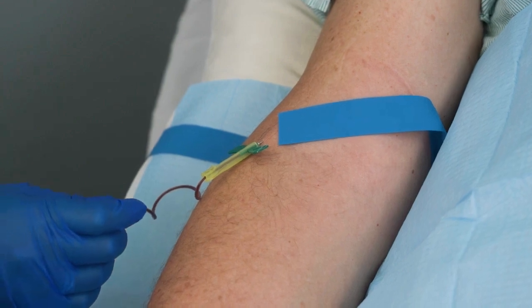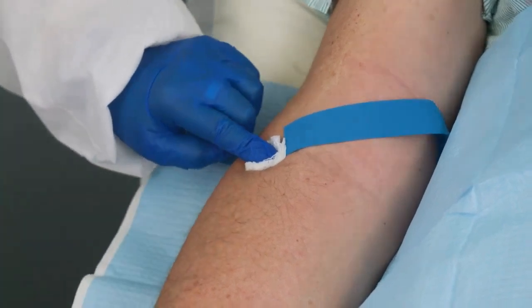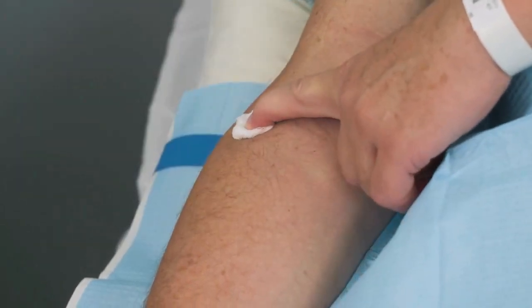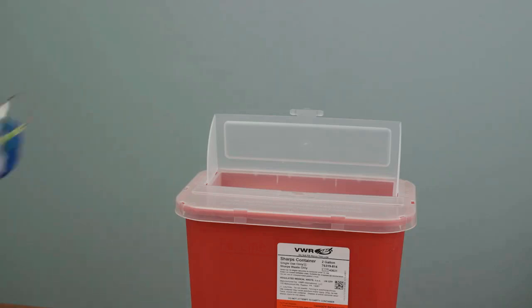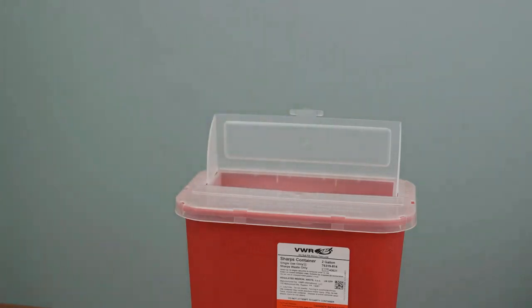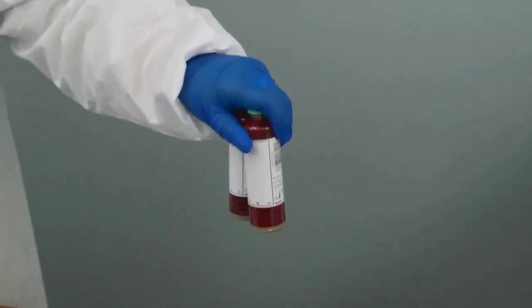Remove the needle from the vein gently and engage the safety device if utilized by your facility. Cover the patient's puncture site with a suitable dressing and apply pressure. Discard the entire collection device into a sharps container and dispose of other materials.